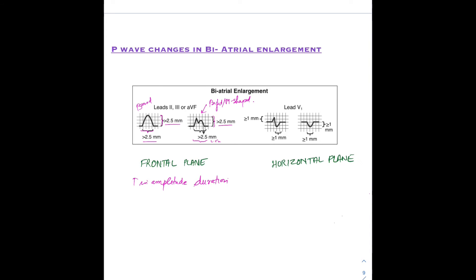In lead V1, there will be a biphasic P wave morphology — a combination of both right and left atrial enlargement changes. In right atrial enlargement there is peaking of the upright portion of the biphasic wave, which is exactly what we see here. In left atrial enlargement, the inverted component becomes bigger — more than 1 mm in depth as well as duration.